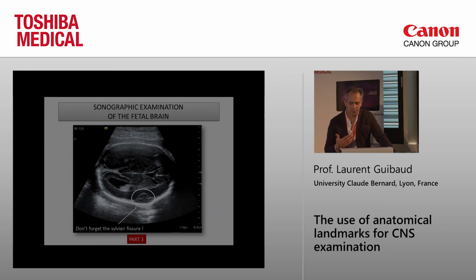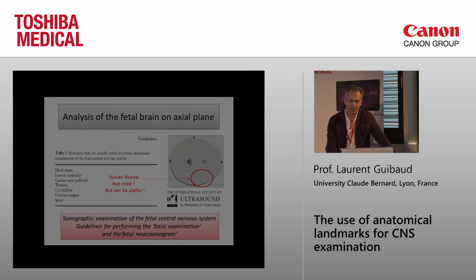For me, it's the most important part. I put my probe, I look at the Sylvian fissure. And the Sylvian fissure is not cited in the guidelines. But you see, on the diagram here, you see the Sylvian fissure. The fissure is here, under your eyes. So look at the Sylvian fissure.